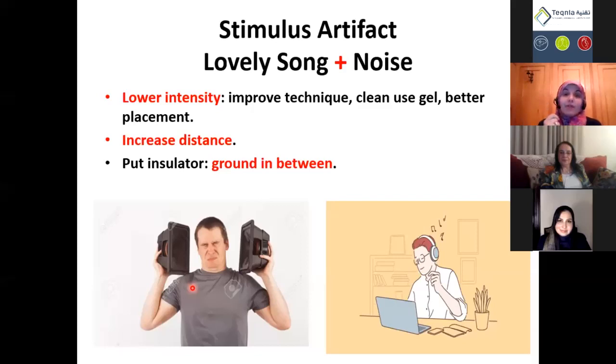But if you didn't clean and you didn't use gel and you put it off point, you will have to use stronger intensity. So proper technique can help you lower the intensity. And if you hear a noise with a lovely song, you want it to be away from you. So increase the distance between the stimulator and the electrodes. I can see the beginners, our dear juniors, putting the stimulator very, very near to the electrodes. I don't know why. You will get the same results when you put it just 1 or 2 centimeters above.